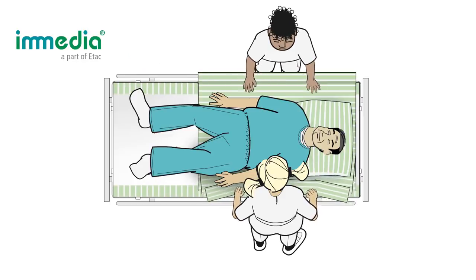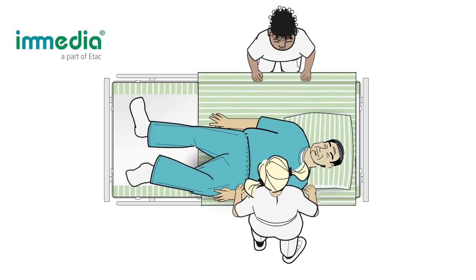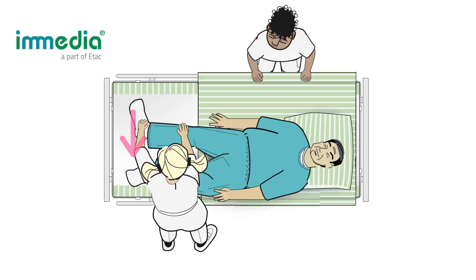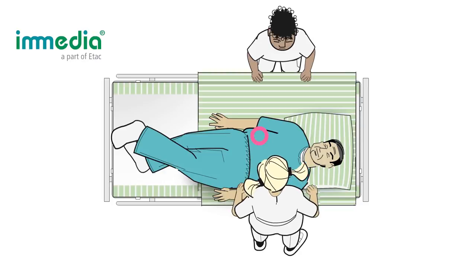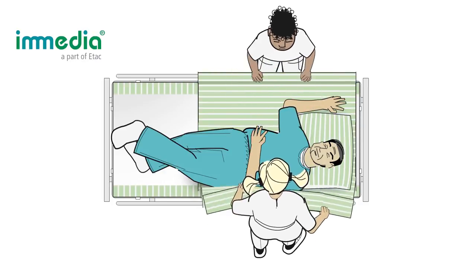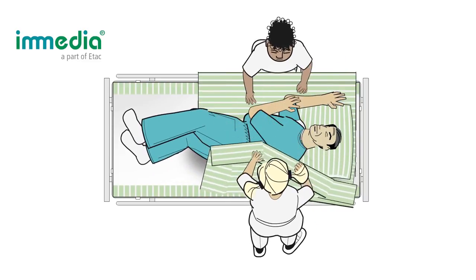When the user needs to be turned in bed, position the user closer to the bedside. If possible, ask the user to cross their arm toward the opposite side of the bed. Assist the user if needed. Use the SatinSheet 4-direction draw sheet to position the user on their side.